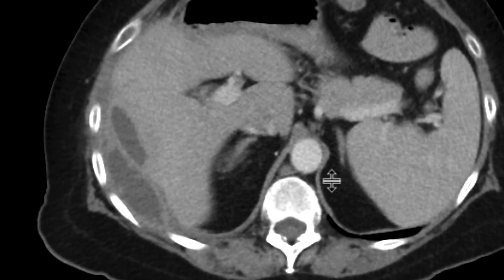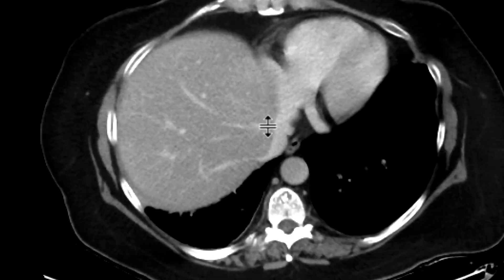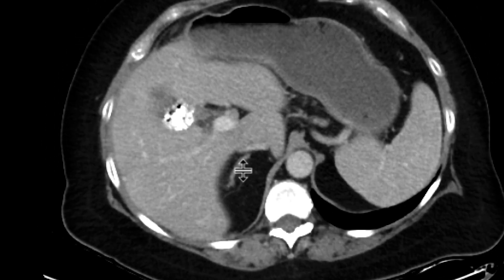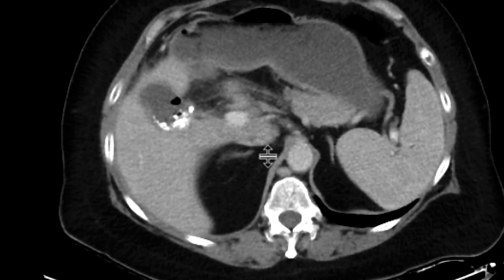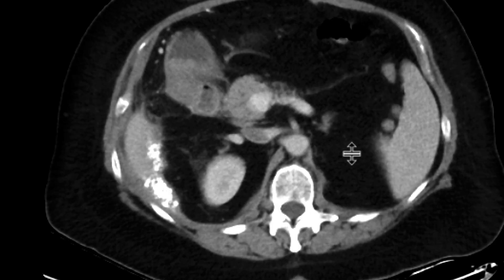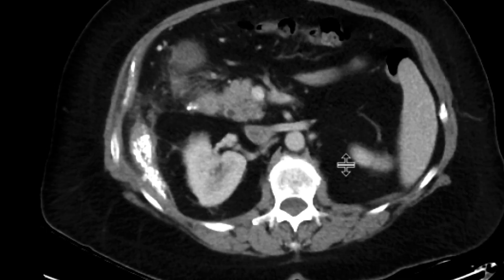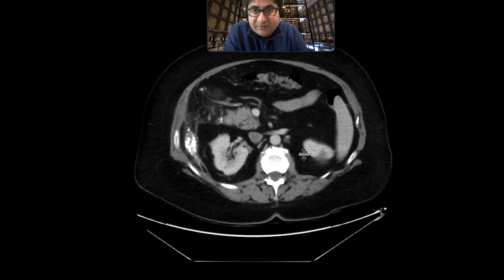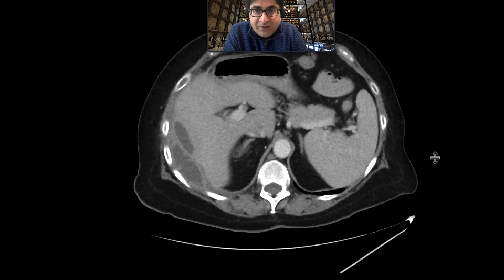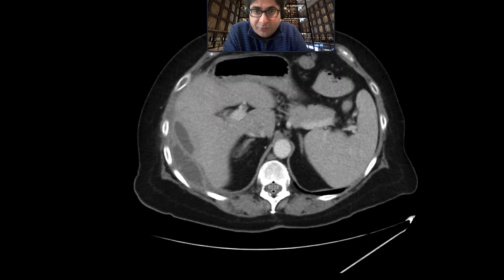If you look back at this patient from several years back, when the patient was more immediately post-cholecystectomy, you can see that there are numerous dropped gallstones in the gallbladder fossa. More dropped gallstones are seen more inferiorly as well. So numerous dropped gallstones in this instance, and over time these resulted in these abscesses, which are causing this patient to have fever and right upper quadrant pain.